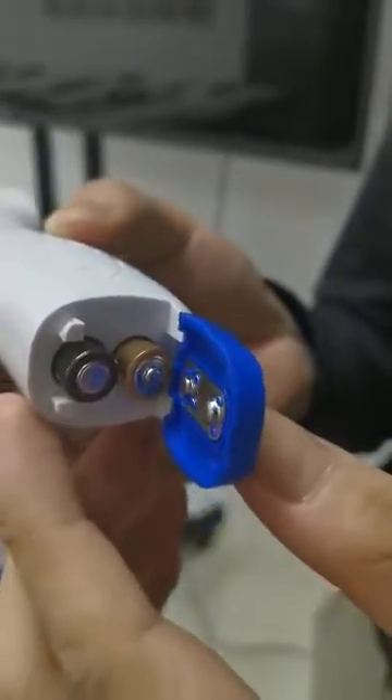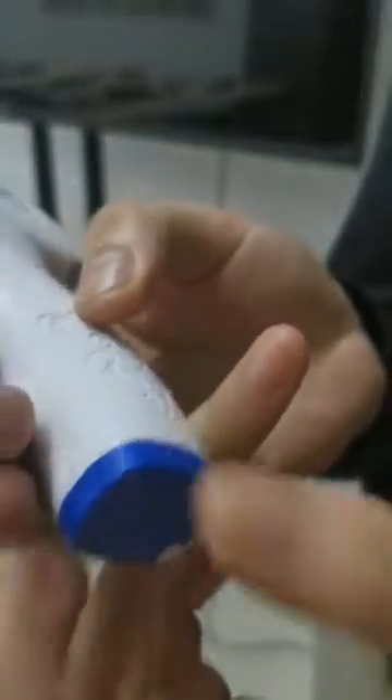After that, I just press it. Okay, that's it. Usually we measure people's temperature either by the hand or by the forehead. If I measure someone's hand, I just face it and press it.